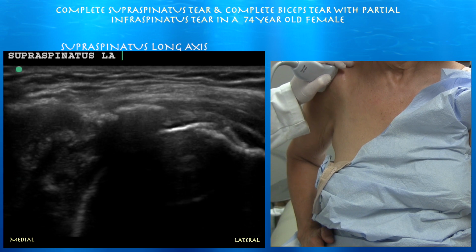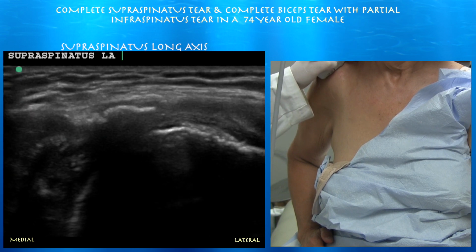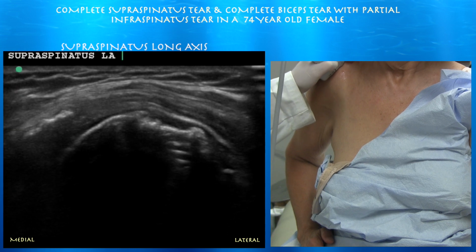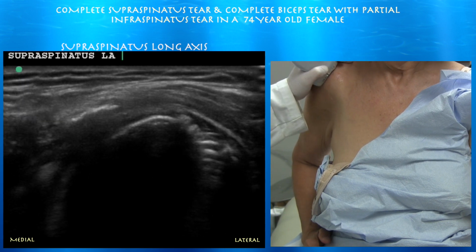We're just looking at some of those suture anchors that we saw in the MRI, and we're really not seeing much of a tendon attached to it. You got basically deltoid muscle going right down to the bone. And one thing you want to make sure that you don't mistake is an interface between the deltoid muscle and the humerus, as it does appear to be a bright line similar to a suture, but that's just an interface of the muscle with the bone.